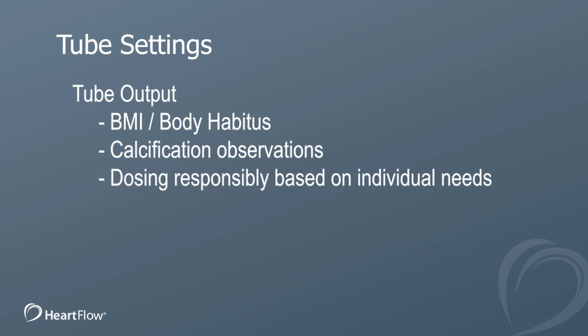We also need to apply radiation responsibly so that the patients get the correct dose for their needs. So for example, if we have a young patient that has no coronary calcium and a low disease likelihood and more risk from radiation exposure, we want to be very diligent about doing what we can to maintain minimal exposure. On the other hand, if we have a patient that has lots of coronary calcium or stents, we may want to increase exposure in order to get diagnostic images. The last thing we want to do is have a non-diagnostic scan.